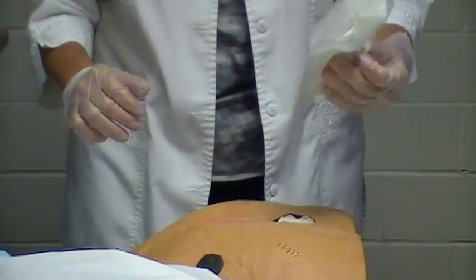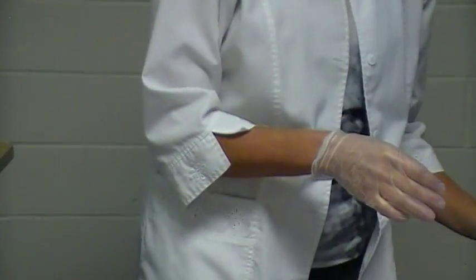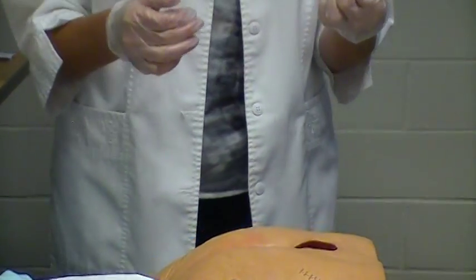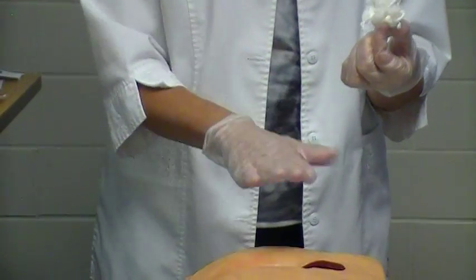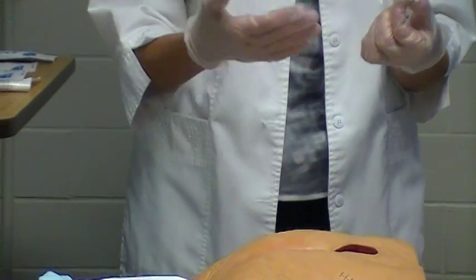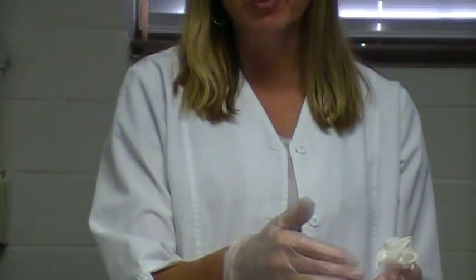Okay, so I'm going to remove the top dressing. This is the old one. I can look at the drainage on it and I can discard it. Then I'm going to remove the dressing that's in the wound. Make sure you know exactly how much dressing is in the wound. For example, somebody may have put in 2 4x4 gauze. So you want to make sure that if the previous nurse had applied 2 4x4 gauze, that you are withdrawing 2 4x4 gauze from the old dressing.